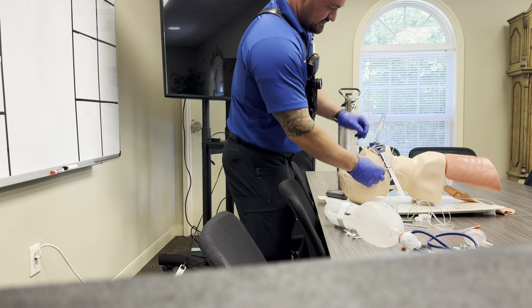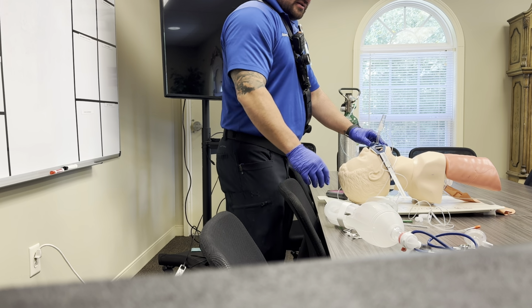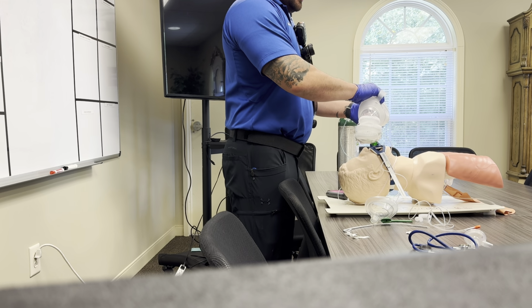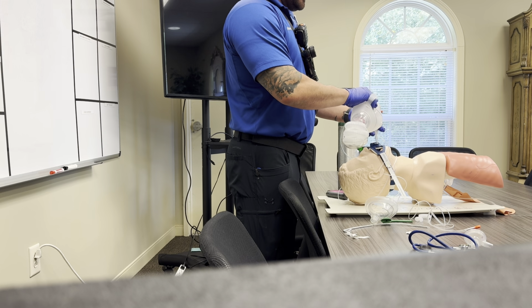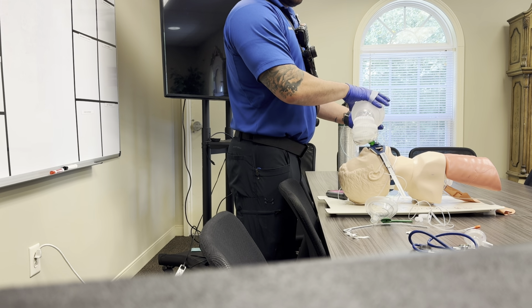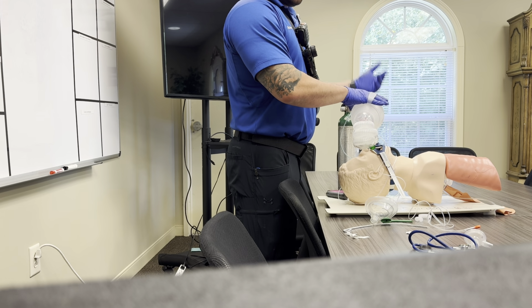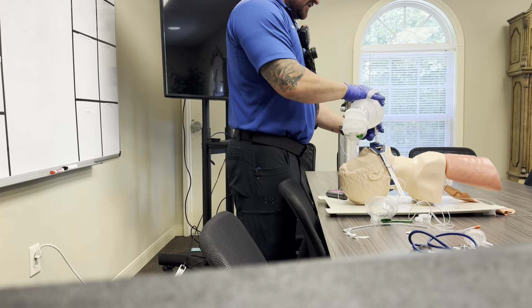It's up to you. In my case, I'll take it off my patient. And depending on what your protocol states, you can use a BVM to ventilate and oxygenate your patient. Obviously, make sure it's plugged into oxygen. Or you can place them on a ventilator. We carry ventilators on all of our ambulances, so we would go straight to a ventilator.